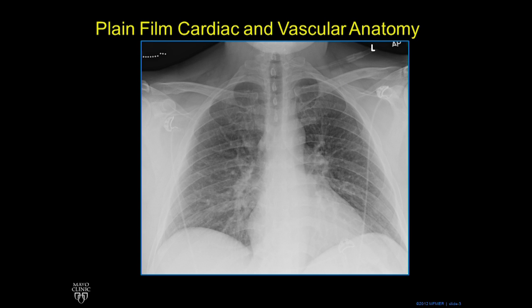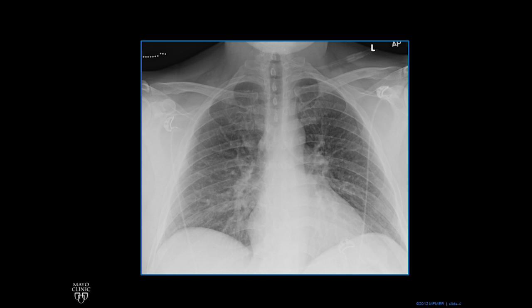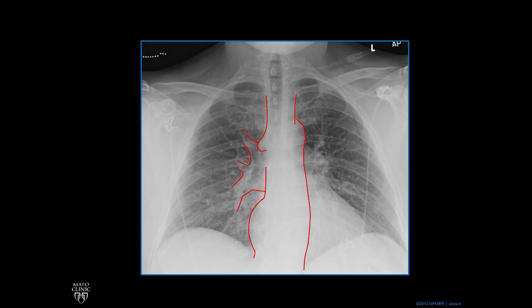We're going to start with a normal frontal chest radiograph — nice and normal. We're going to look at these contours: the SVC, the azygous vein, the pulmonary arteries and pulmonary veins together, the right atrium, the left subclavian artery, the aortic arch and the descending thoracic aorta, the hila on the left which is mostly pulmonary arteries, the left atrial appendage, and the left ventricle.